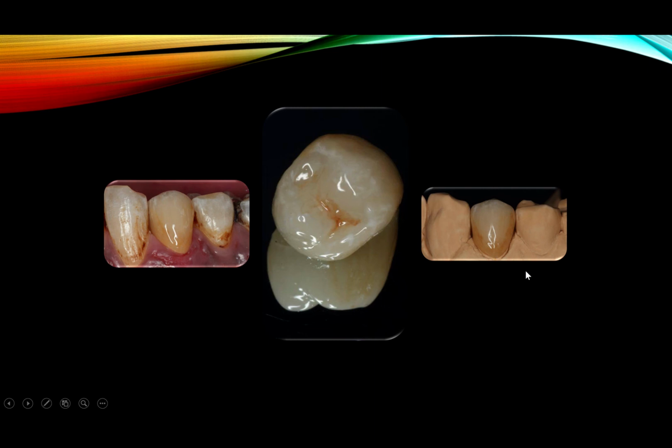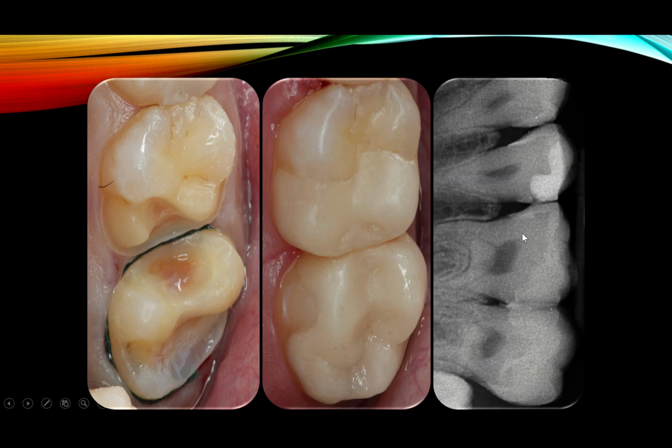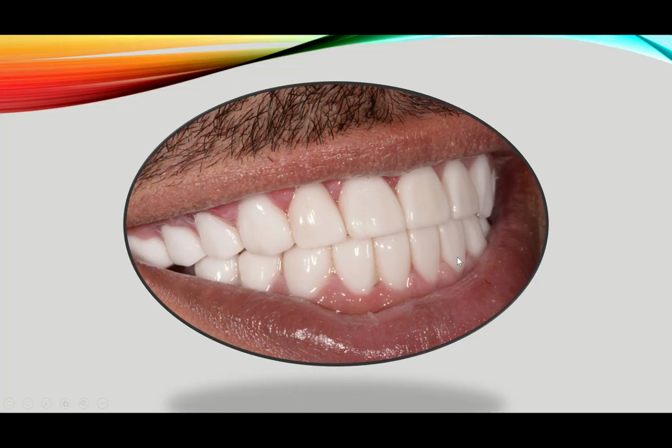Monolithics are not that bad, in other words, especially if you do them in lithium disilicates. And some people even get very good with zirconia. This is without staining. This dentist takes things without staining. After, I don't like anything without staining or characterization anyway.